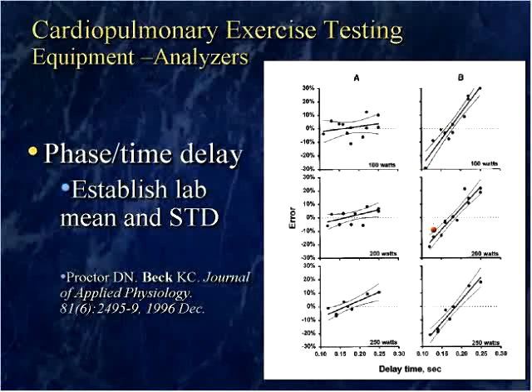Things that can affect the phase delay is if you get water or dust or dirt in your sample line, if you get a kink in your sample line for your analyzer system, all of those things affect the phase delay and can have a profound effect on your test results.